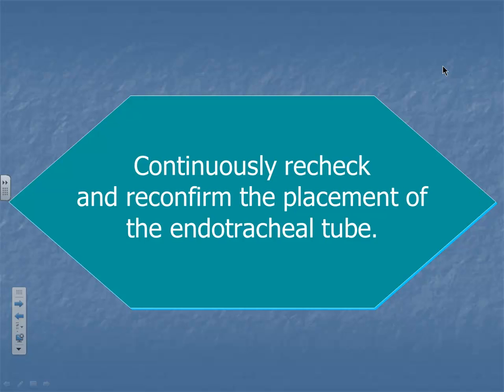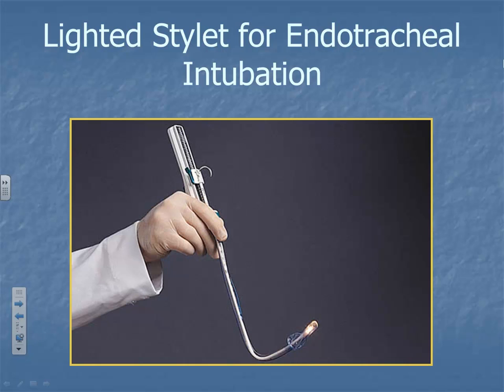If you're having a problem ventilating your patient, either the O2 sats dropping or your capnograph, you're getting crazy, strange things there, crazy waveforms, then you want to check your DOPE. Always check your DOPE. This is not Colorado. We're not checking dope in here, okay? All right. Oh, we just recorded that.